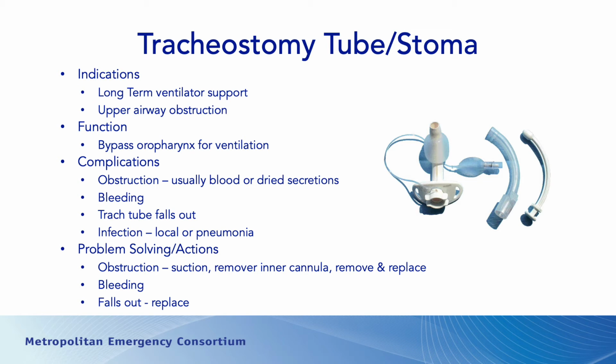Sometimes the tracheostomy tube cuff has been overinflated and it causes tracheal breakdown, and that can cause some bleeding as well. Those are bad problems that are very difficult to manage, and really, other than transporting the patient, you don't have much you can do in the field.